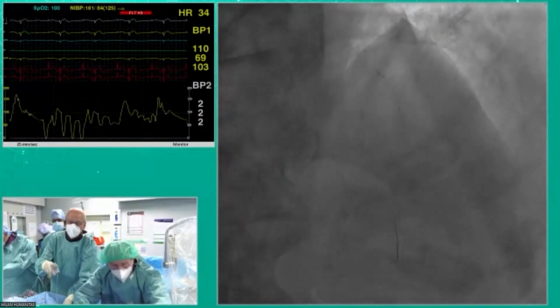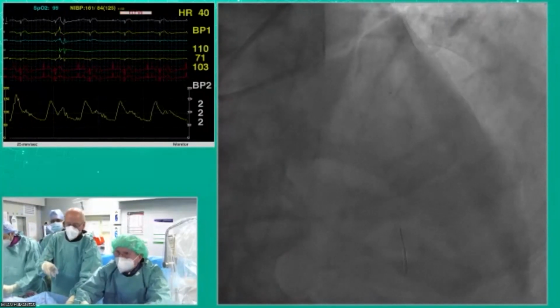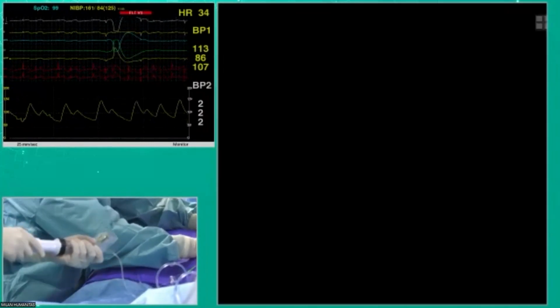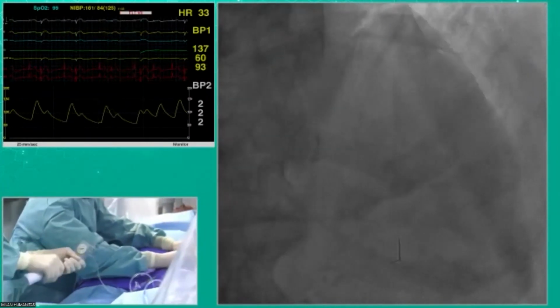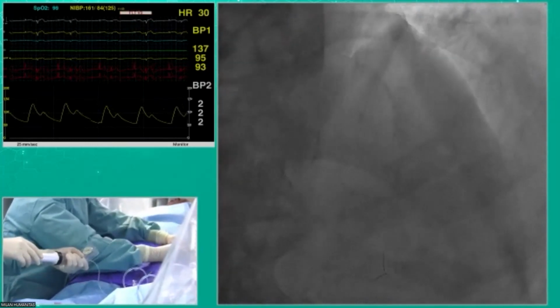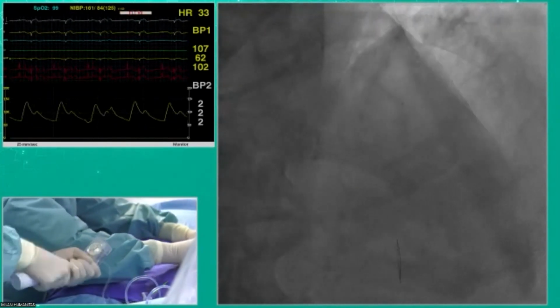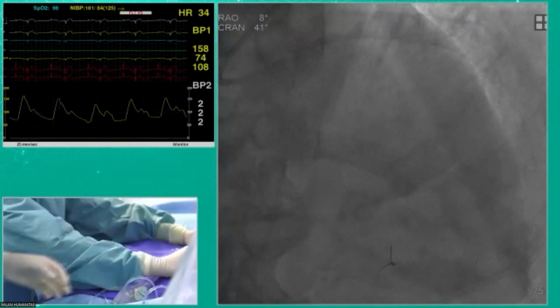What anticoagulation are you on, Dr. Colombo? Here, heparin 9000. Do we already have the ACT? Okay, inflate. It's 260 for the ACT. 6, 7, 8, 10. 10 is okay, not too much. Down. Then the microcatheter, the FineCross. Heart rate is only 28 to 30, sir. Probably because of the bigeminy. Down. Balloon goes down well. Let's take a picture. Ready?